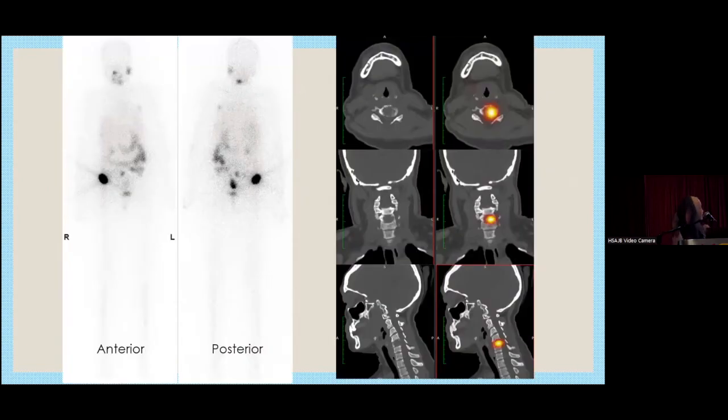This is an example of a patient who has multiple metastases of the bone. As you can see here, there is uptake here in the neck, which from planar we can tell is more likely to be bone rather than the thyroid remnant. Why? Because it is more prominent posteriorly. And true enough, when we do a SPECT-CT, you can see that there's uptake at the C7 level with lytic changes on CT. You can see here, right? So there's lytic changes there.